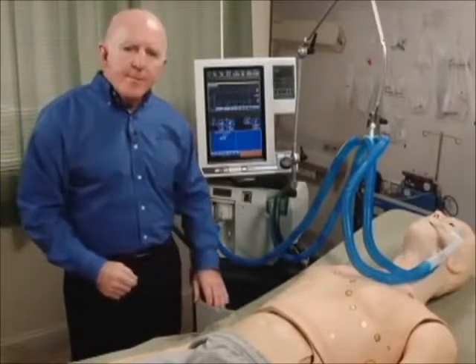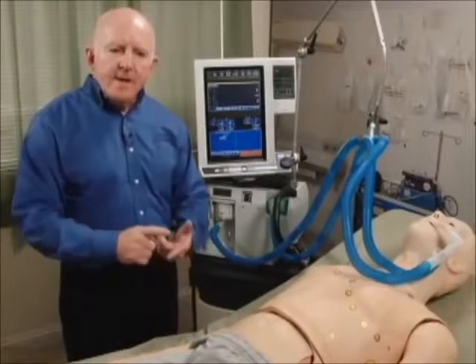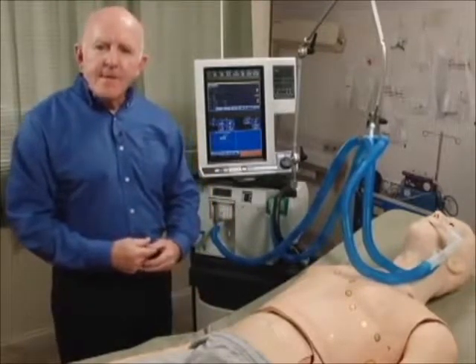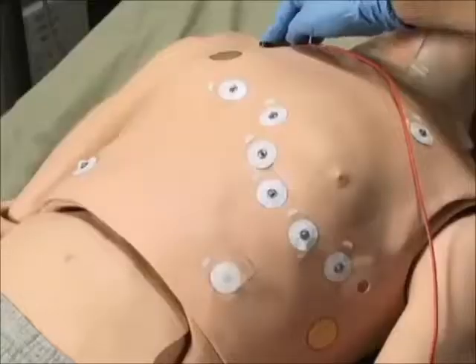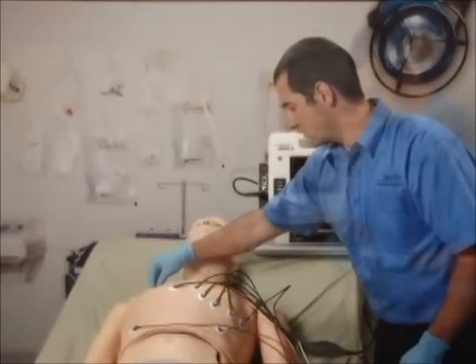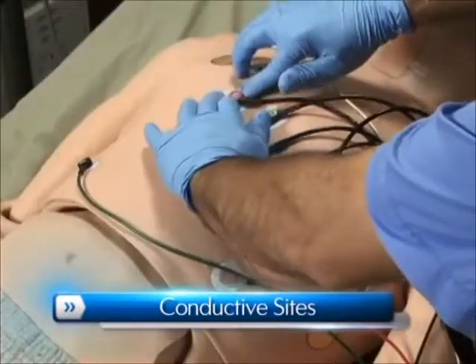Once again, very important to remember, this can all be done while the mannequin is running, demonstrating worsening situations, making for very excellent HAL scenarios. Several realistic heart sounds, which are tied to a user-defined heart rate, are selectable. HAL is equipped with 10 conductive sites to allow the use of a real 12-lead ECG monitor.